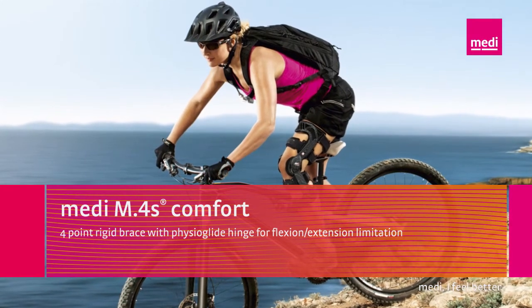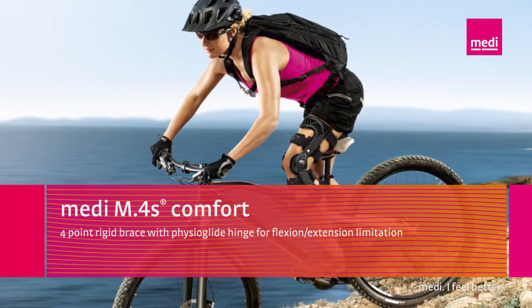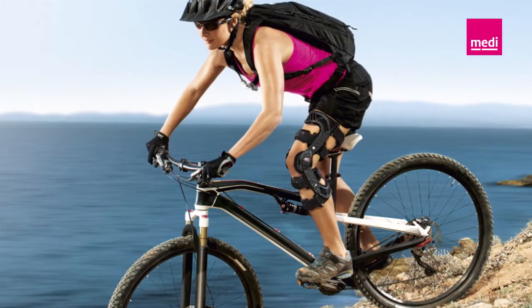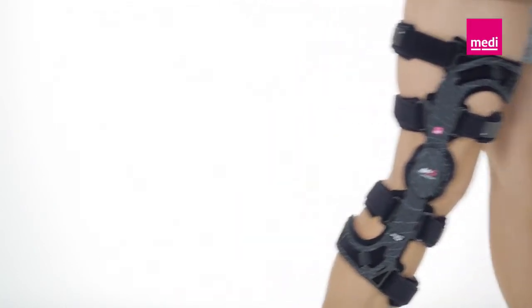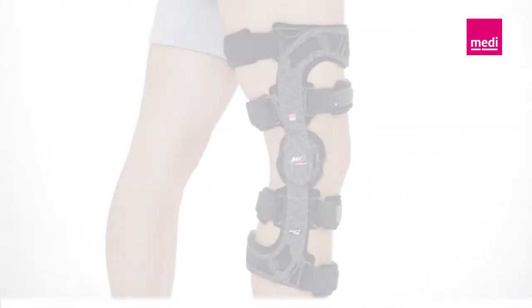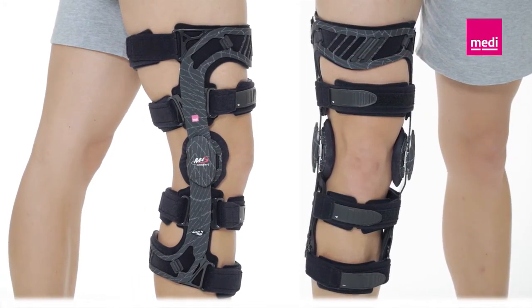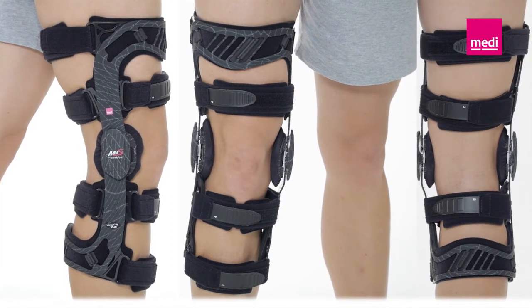A warm welcome to the training videos from medi Orthopaedics. The following film will give you helpful hints on patient care with the medi M.4s Comfort Knee Brace. The M4S Comfort is mainly used for ligamentous injuries in the knee joint. The knee brace ensures the necessary stability after surgery and during conservative treatment, especially in association with cruciate ligament ruptures.